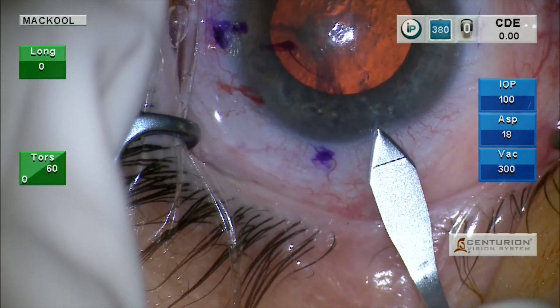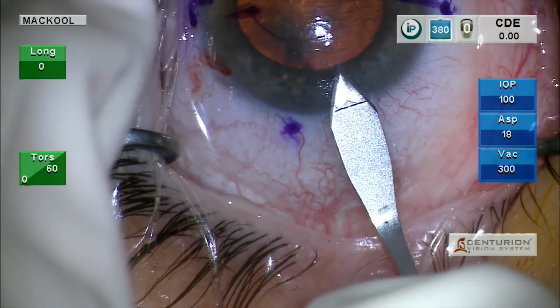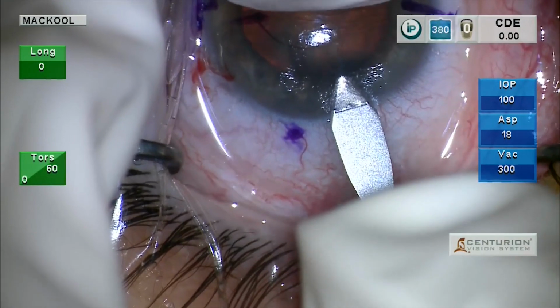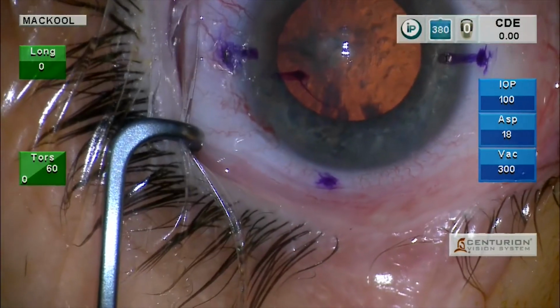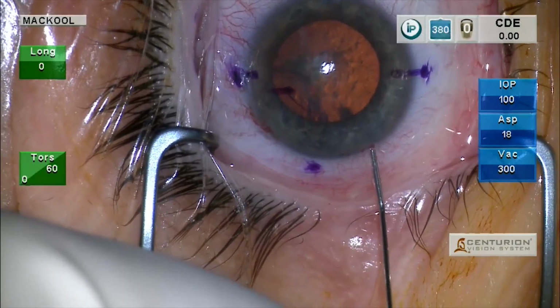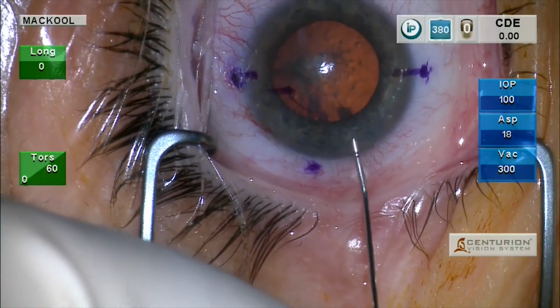Now comes our 2.4 millimeter typical incision, which is 2 millimeters long. The line shows you that, 2 millimeters. And then we dimple down, as we say, and then wiggle to go in slowly. Next, advise the patient that they're going to feel some stinging if you're doing it under topical, and you might feel some stinging here. A little intraocular lidocaine.